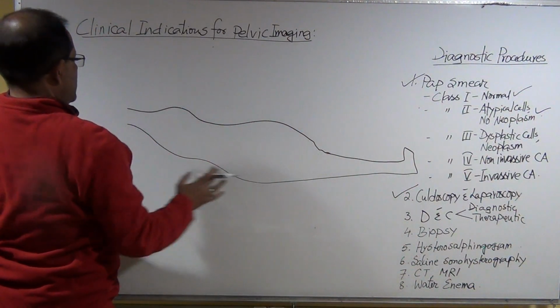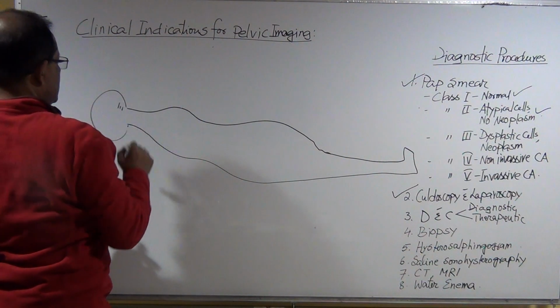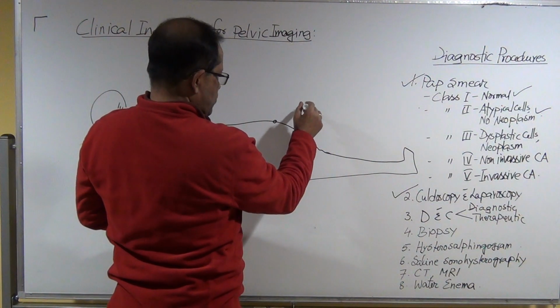Okay, so this is body, so the head is here. Okay, so now this is umbilicus here. They insert the instrument.